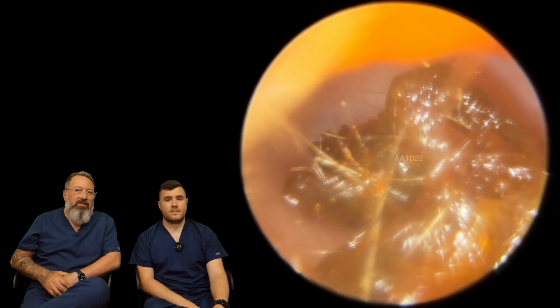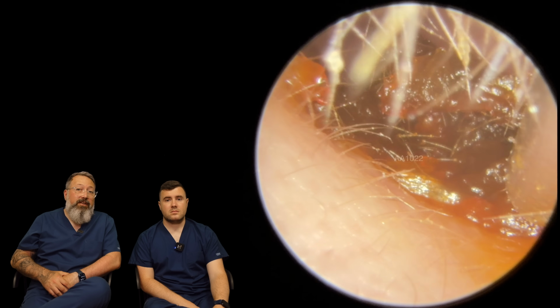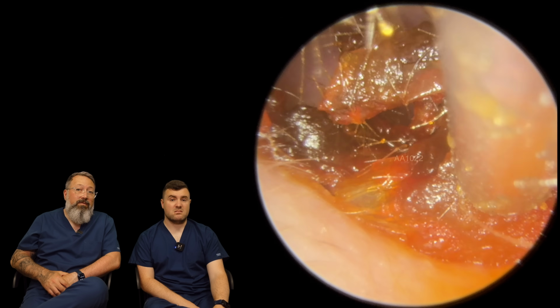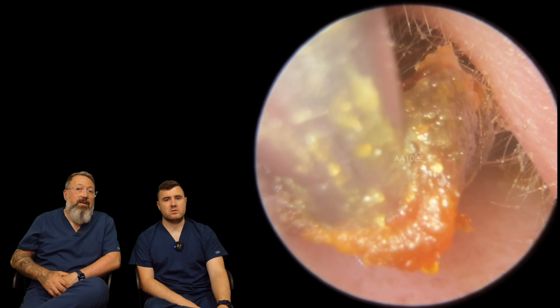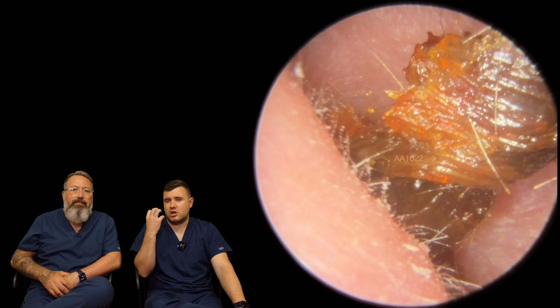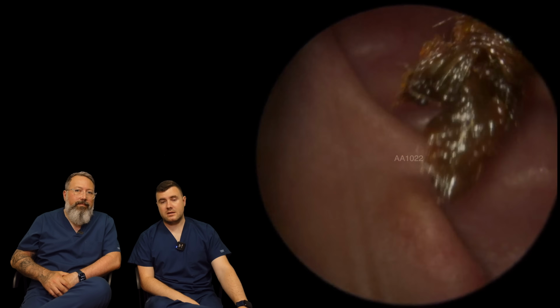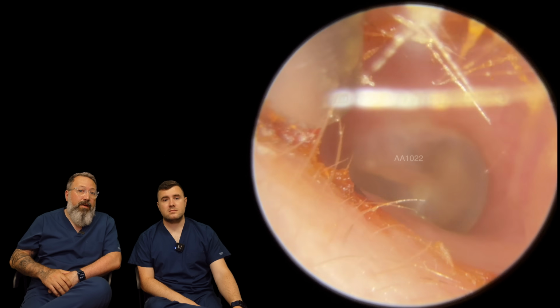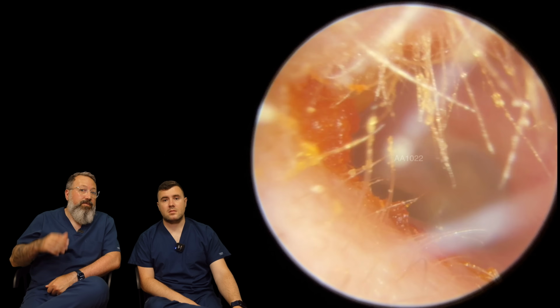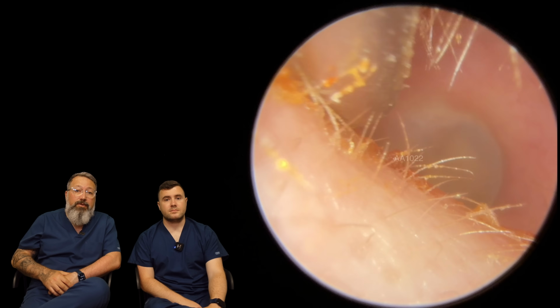Just having a good look, checking out any gaps we might be able to exploit if we need to, but just detaching from the entrance to the canal. There we go. Look at that. The patient wouldn't have had any issues with the hearing on that one. Not on that one. Like itching and just essentially a sensation that something's in there. Something moving around, or the other one we get a lot is patients who have baths and showers, and they're feeling constantly blocked up after it, so getting a water trap behind it. That's the other thing you'll experience on this one as well.